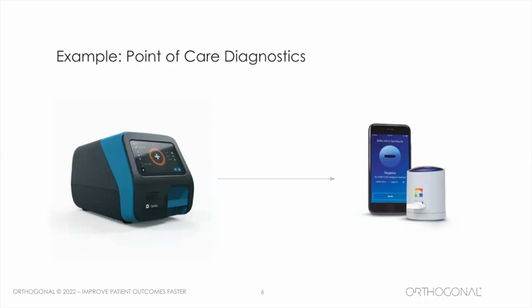The latest version here that we worked on is a Sophia Q device on the right side. And in that case, you can see that it is a much smaller device. In fact, it's got a lot less smarts in there. The bill of materials is much, much lower. It connects via Bluetooth to a smartphone, and the smartphone reads the barcode on the assay, knows what kind of test it is, and then tells the device what to do and pulls the data out.